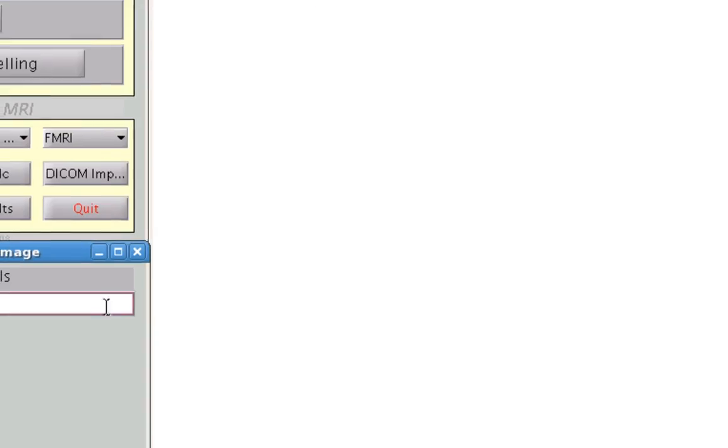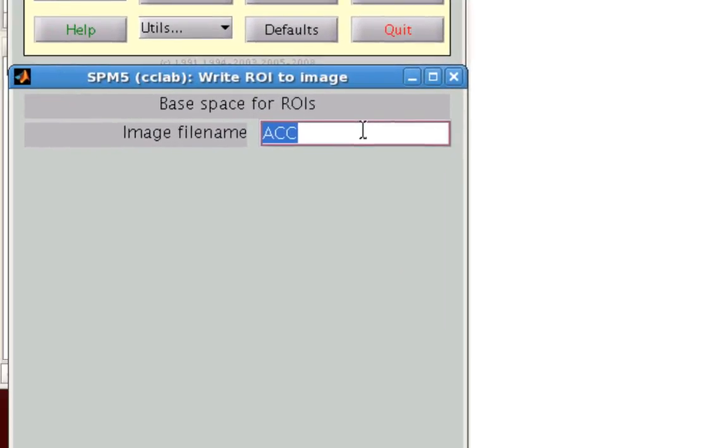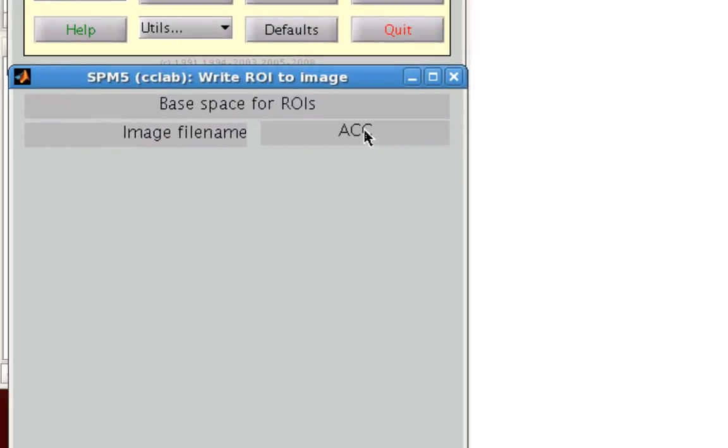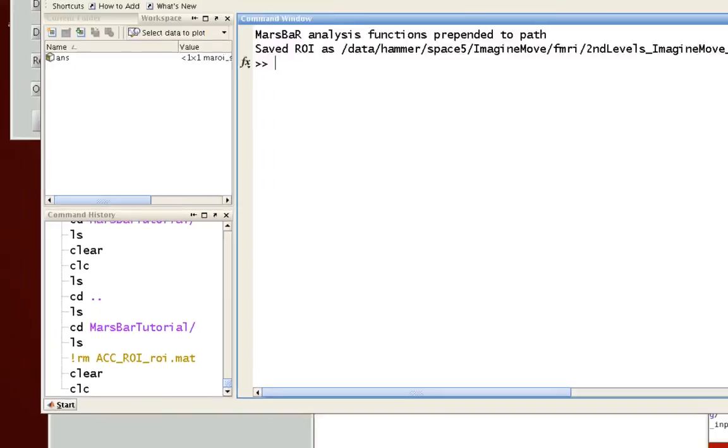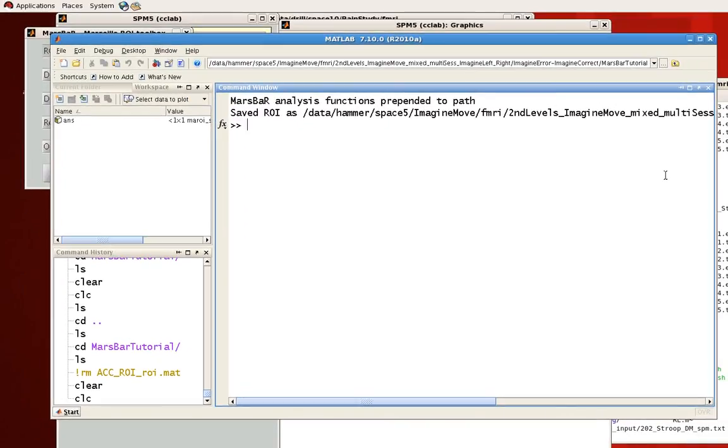So go ahead, click Done. Image file name, again, let's call this acc. So it successfully output that. And now you have an ROI in both a .mat file and in a nifty file, which you can then use for further SPM analyses.